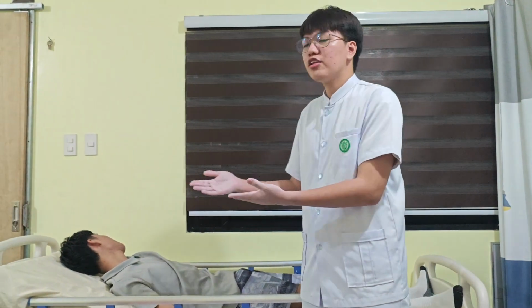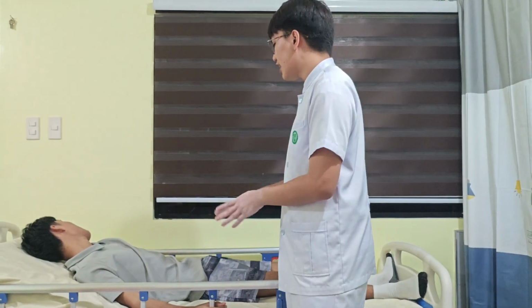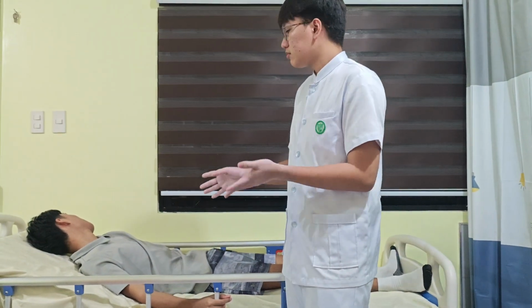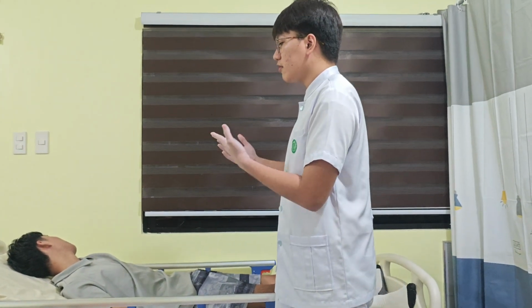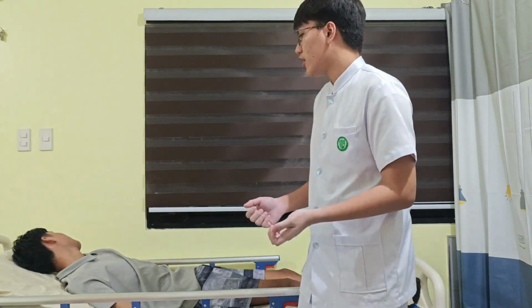Good day. So now I'll be demonstrating patient transferring from bed to wheelchair. First, we're going to check the medical record of the patient to validate that the correct patient is receiving the correct treatment and procedure. After that, we're going to check for IV lines, incisions, and tubes to reduce the risk of injury. After that, we're going to assess the patient's limitations to better determine the best way to transfer the patient to the wheelchair. After that, I'm going to perform hand hygiene and put on gloves.